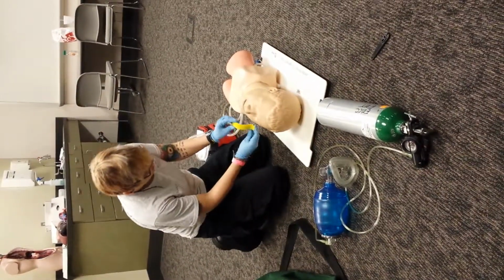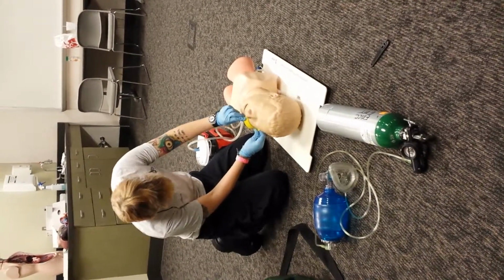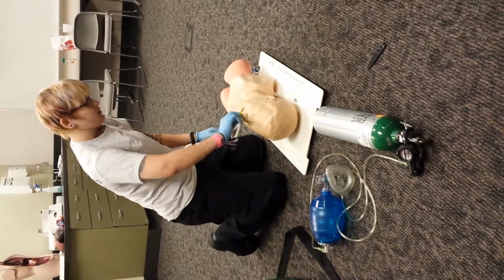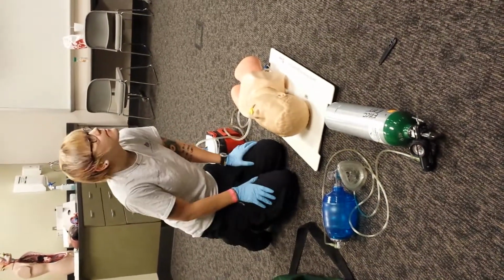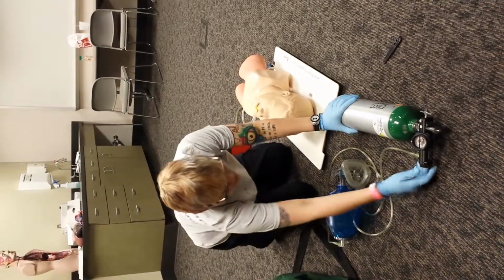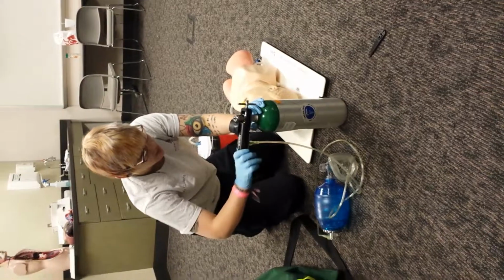I'm going to measure the oropharyngeal airway adjunct from the corner of his mouth to the tip of his earlobe, and it's the right size. I'm going to push it flush against his lips. No gag reflex is present and the patient accepts the airway adjunct. I'm going to turn my supplemental oxygen to 15 liters per minute.